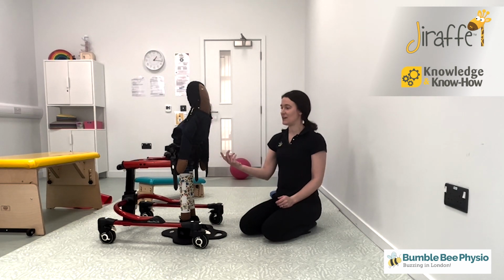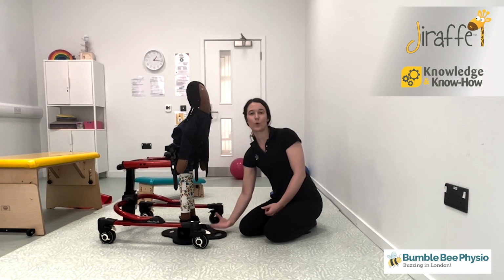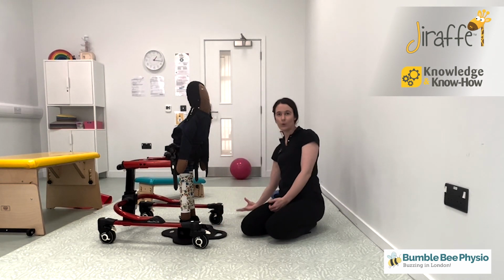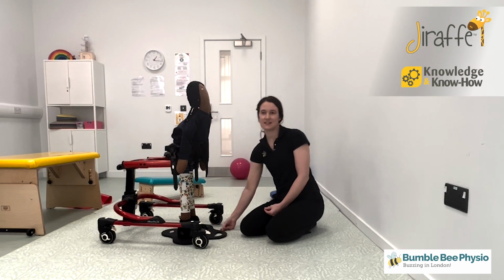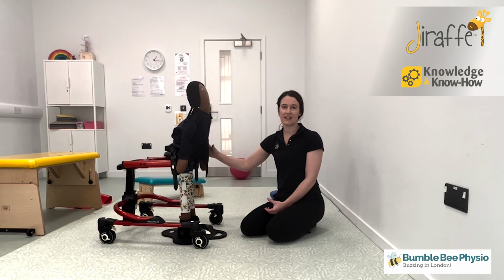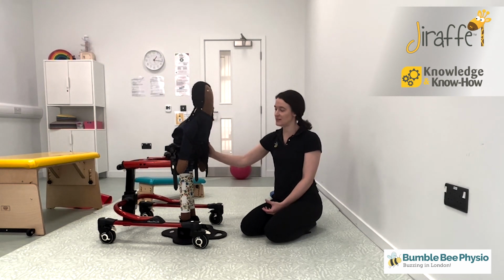And to isolate that as well, and to stop the rotation that happens, you want to be holding toys always down. So not necessarily all the way over here to get trunk rotation, down but slightly to the side, and then you might want to restrain the other hand for children who have less ability to follow instructions.